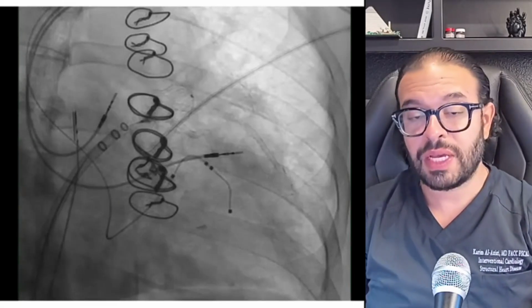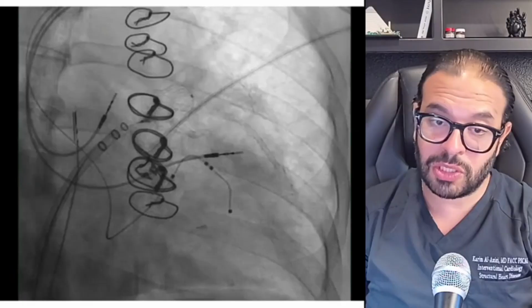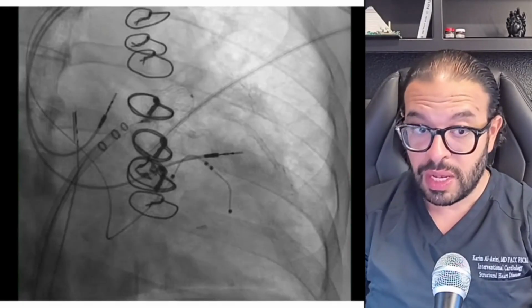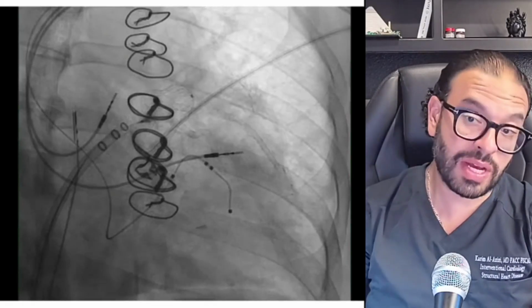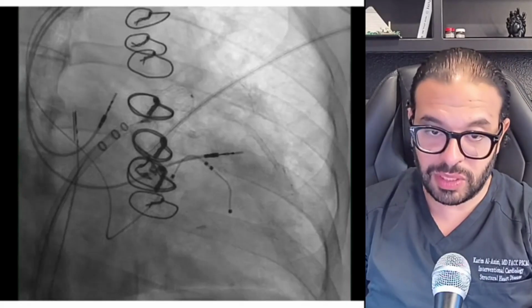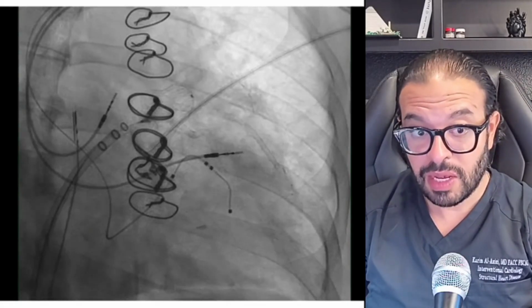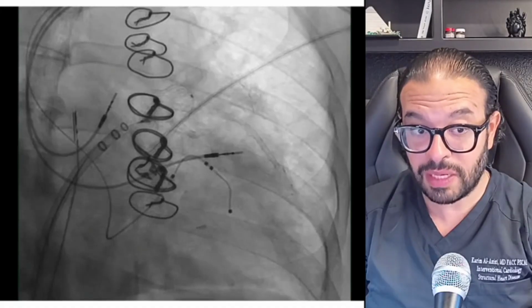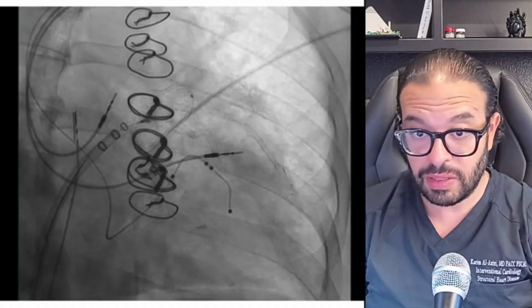Because at the end of the day, Sam, we're doing a preventive procedure, and the promise to the patient is to prevent strokes. Leaving any gaps around these devices because of not visualizing it really makes this procedure not something beneficial, but perhaps even harmful, because now we actually stop anticoagulation right after these procedures and just put them on dual antiplatelet therapy.